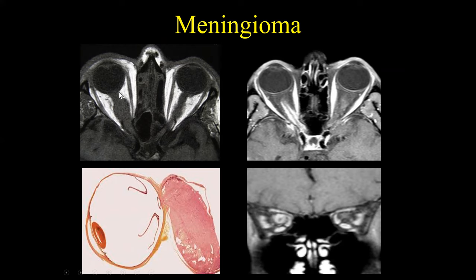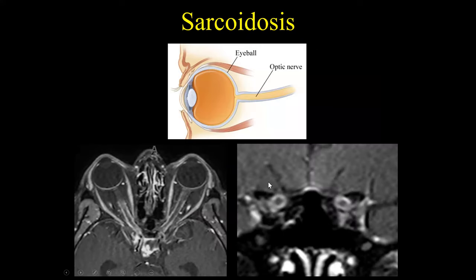Here is a patient with a so-called intraconal mass involved in the orbit. On contrast-enhanced T1-weighted images, there is a central area not enhancing but with peripheral enhancement. On coronal images, we see diffuse enhancement of the dura and compression of the optic nerve. If you understand that anatomy and see diffuse enhancement with compression of the optic nerve, you can suggest the diagnosis of meningioma. This is the classic tram track appearance seen with optic nerve meningiomas.